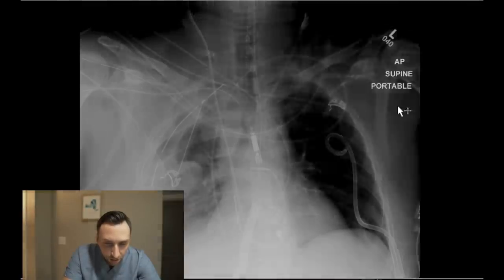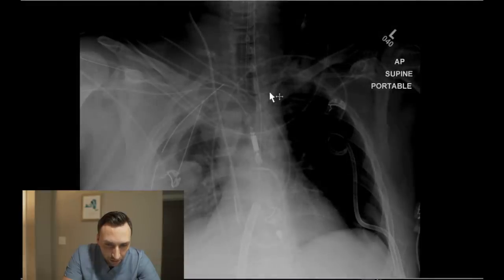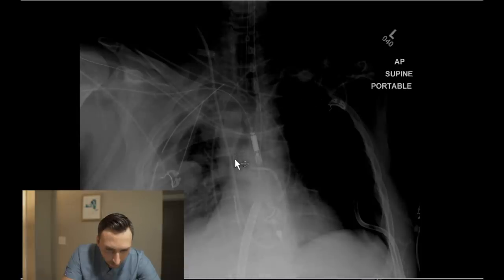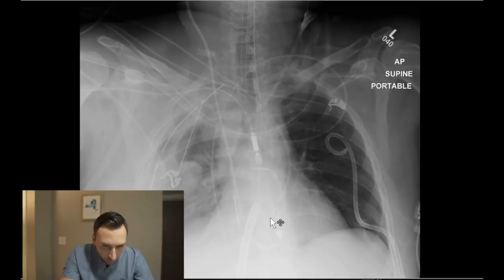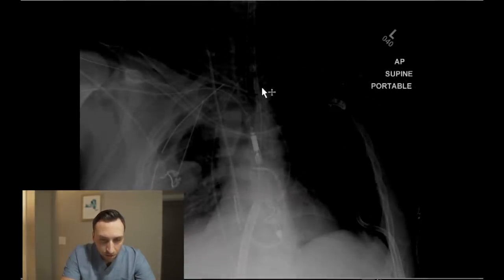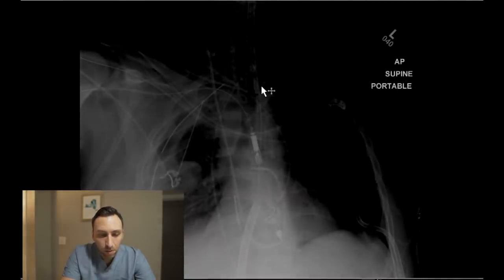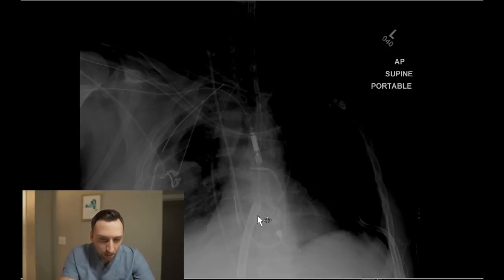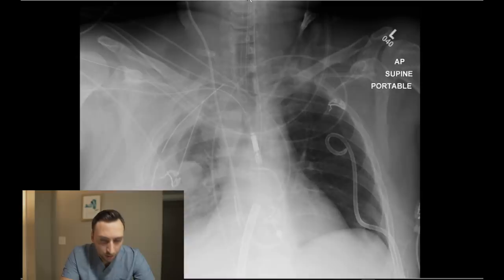Next, working my way to the left, we have a left IJ approach central venous catheter coming down — it's very difficult to follow down through here, but it ends in the right atrium. Next we notice an inferior approach ECMO cannula, which I presume is a right femoral approach ECMO cannula, and it is overlying the right atrium as well.